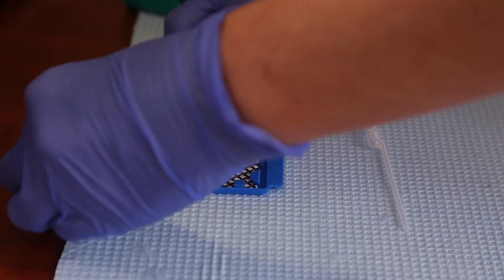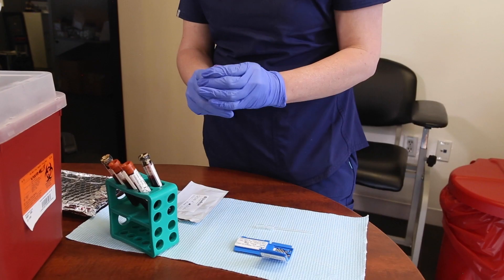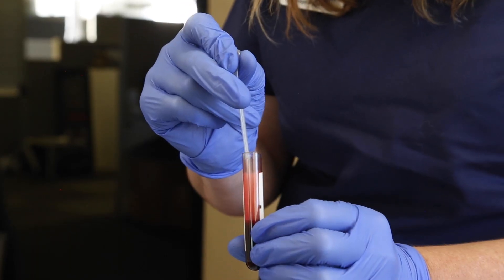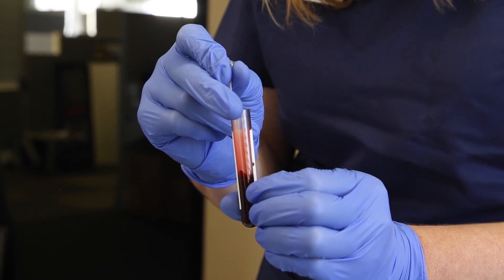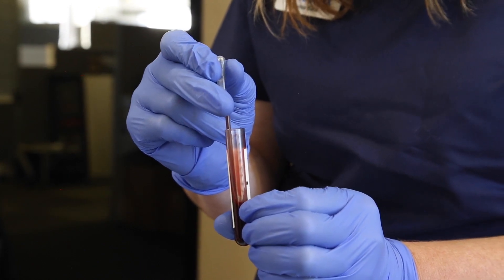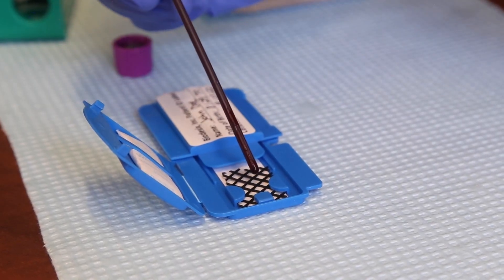Now, open the blood collection device and lay it out on a flat surface. Pick up the purple topped EDTA tube and remove the top. Collect blood using the included single use pre-measured pipette. To properly use this pipette, position the pipette into the blood vial while fully depressing the top bulb. Gently release the bulb to pull blood into the pipette, filling the long tube and reaching the pipette reservoir.